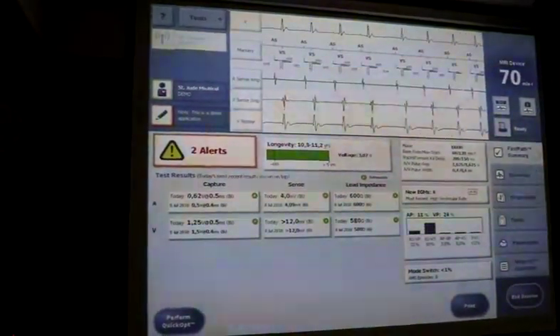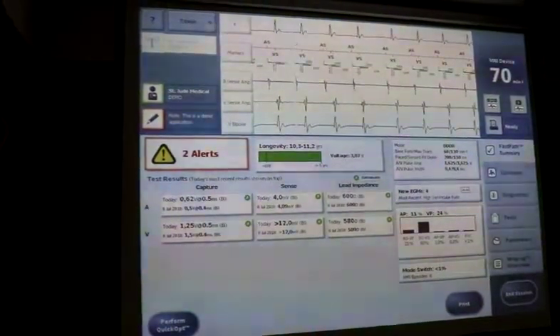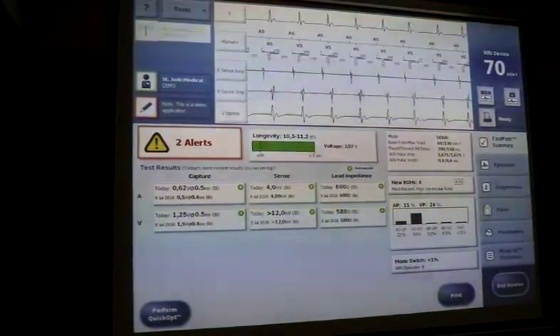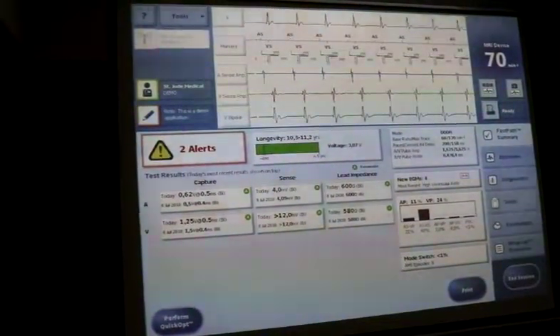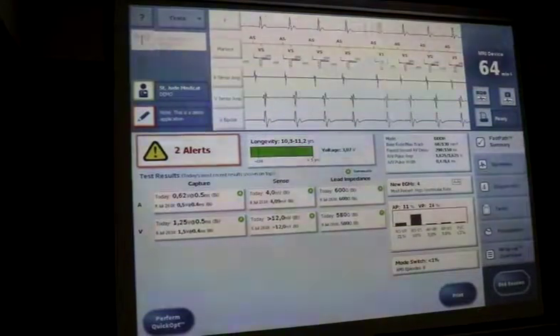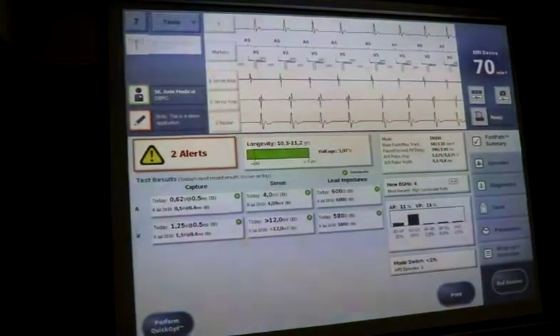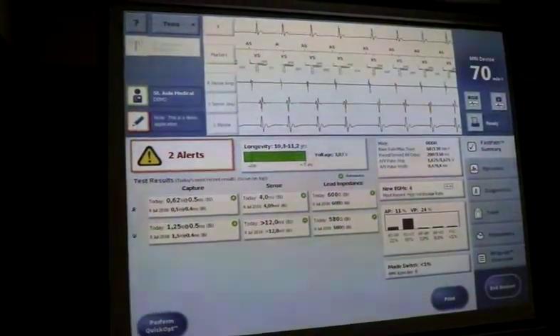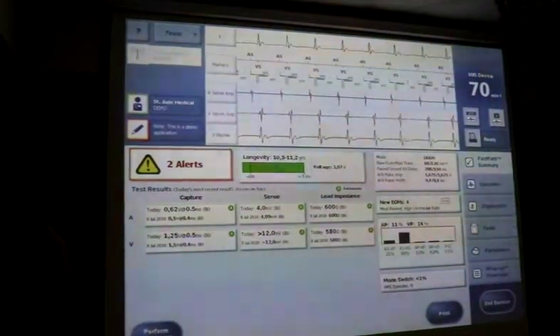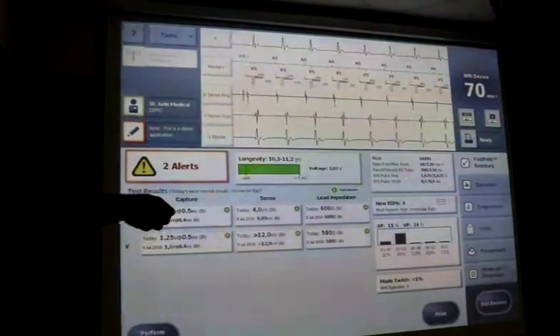So we decided to put a pacemaker in. Reasonable to put a pacemaker in, yeah? You choose a dual chamber? Yeah, she's dual chamber, okay. We don't know if she's got paroxysmal AF. She probably has, she's the right age and stuff, so we probably want to pick that up. Okay, so we'll just go in here.